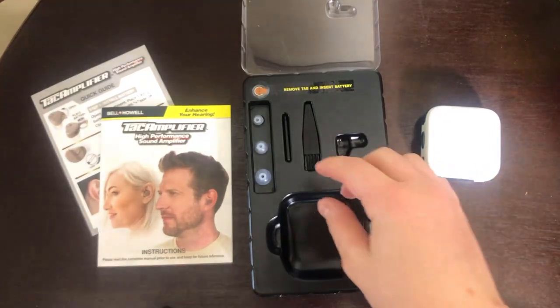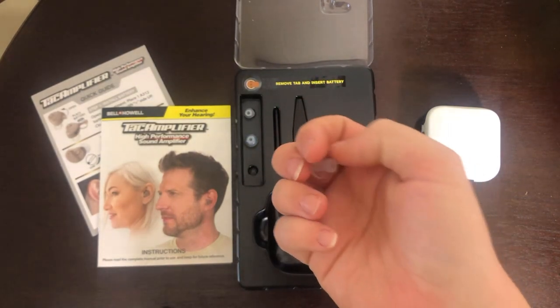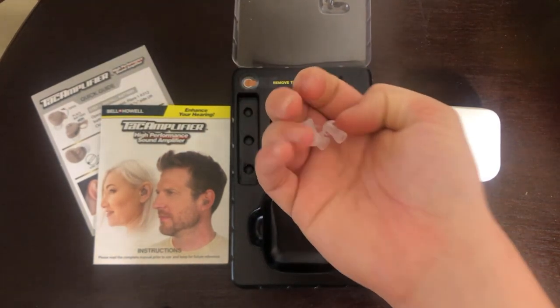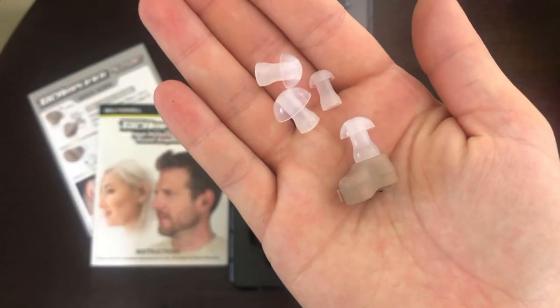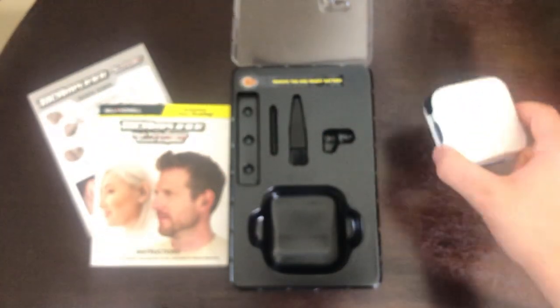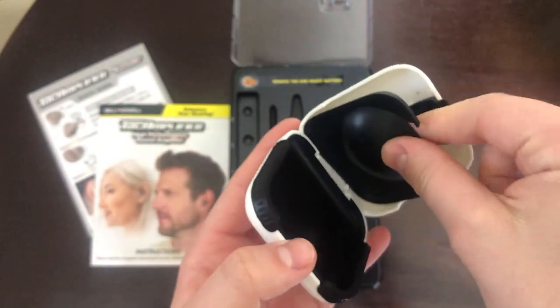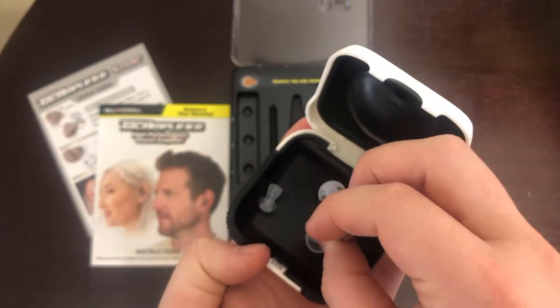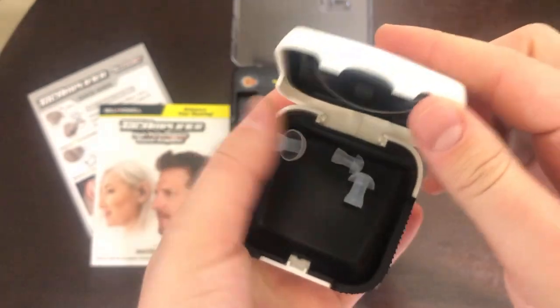These are the variety of different earpieces — there are large and very small ones, so they give you a great variety of sizes. I went ahead and put the right size on for me. I tested out the different compartments just to see, and you can keep everything in the nice little carrying case, which is awesome.